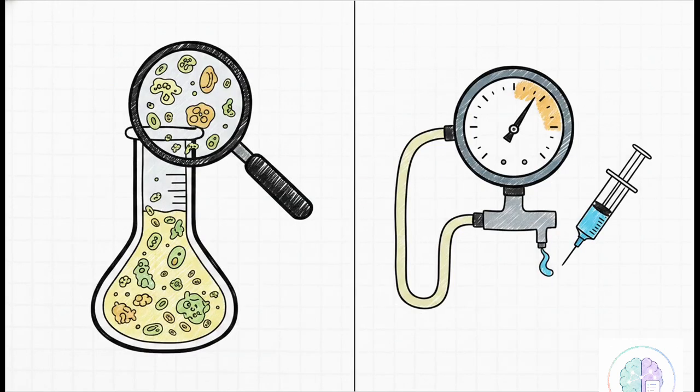Focusing on the first 2 pillars, you'll very commonly tap to get CSF to check for a shunt infection, or you might need it for cytology, like if you're screening for malignant cells in a patient with a primitive neuroectodermal tumor, or PNET. Sometimes you even tap just to physically clear out blood after an intraventricular hemorrhage. On the function side of things, tapping lets you directly measure those opening pressures we talked about and precisely control your proximal or distal injections of contrast.